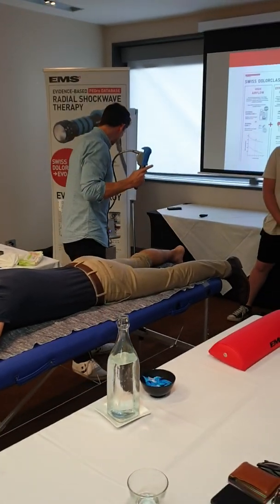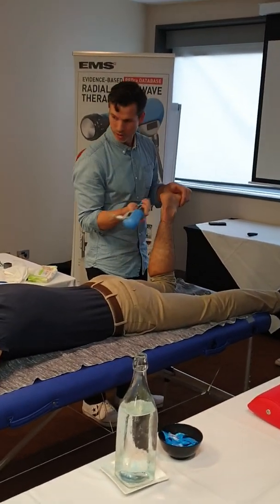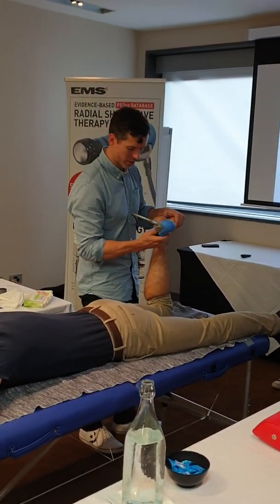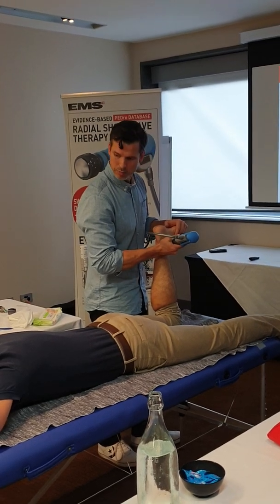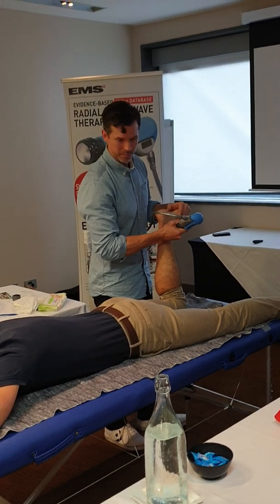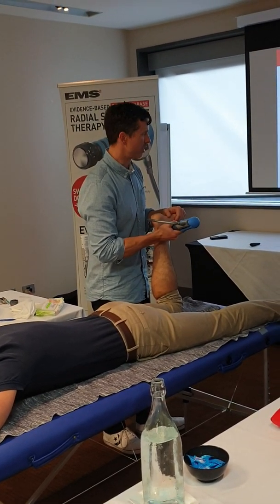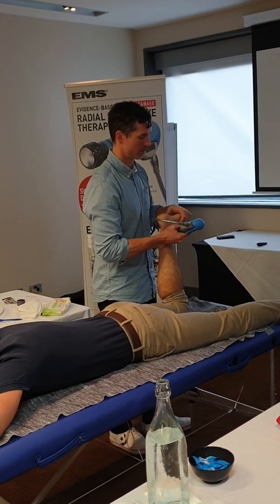So I'm getting bored. I'm going to crank it up. Now, so we've got it on 20 hertz. You tell me if this feels different. Better or worse, the same? A little better. Yeah, again, a little bit better. And I'm getting the job done faster.